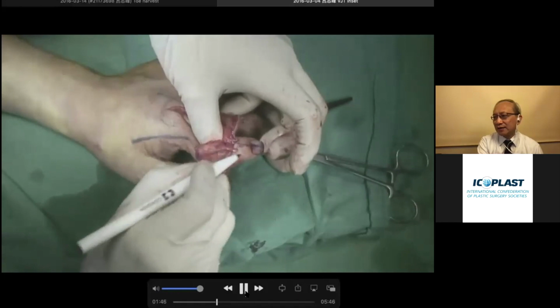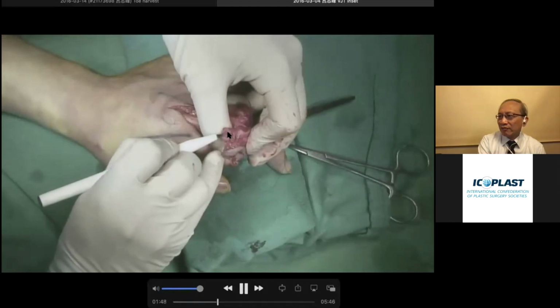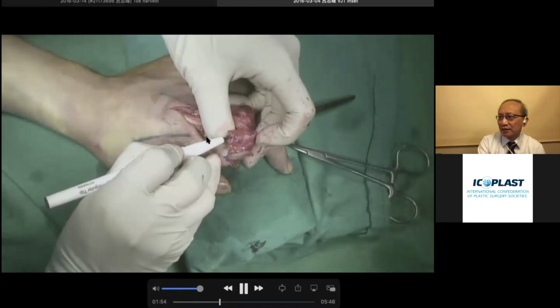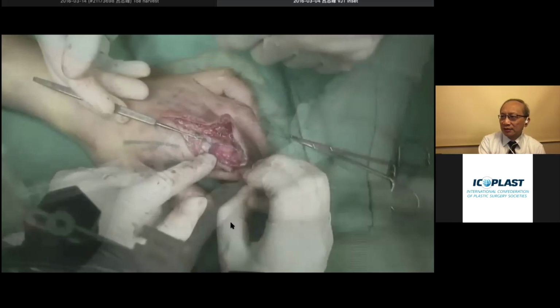So here is another important point: how to define the true AP axis. You can see that I look from the distal to the proximal, the axis of rotation, that would be the true AP axis of the proximal phalanx here. Do not be fooled by the shape of the toe proximal phalanx. Sometimes it would be a little bit oblique or elliptical. So you thought that the AP was like that, but that was wrong. So you have to make sure that you rotate your fingers and see the axis of flexion, DIP and PIP, and then mark your true AP axis, then do the drill hole.